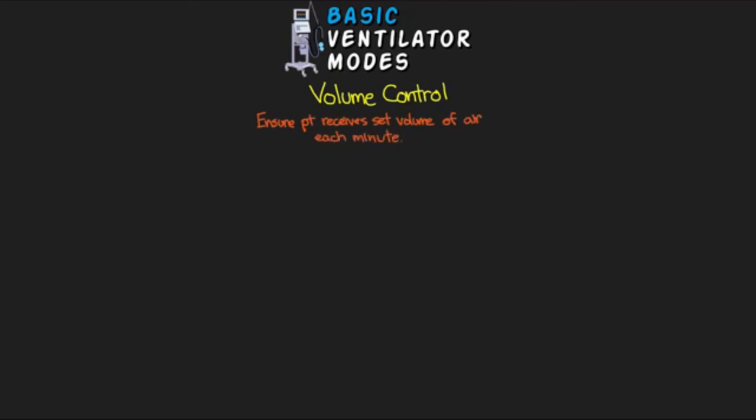And like I said, within this category, we have different modes that ultimately play a different role in the impact on our patient's work of breathing. In order to understand the differences between these modes, though, we really need to talk about some of the settings and some of the things that we're going to be looking at on our vent.